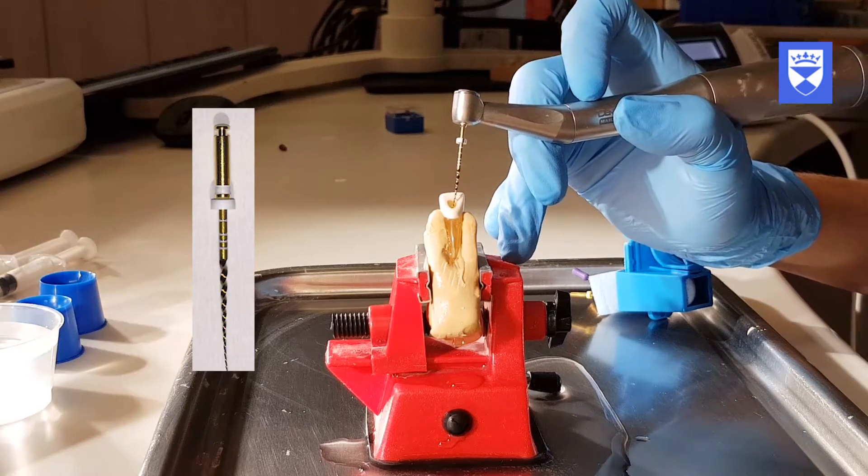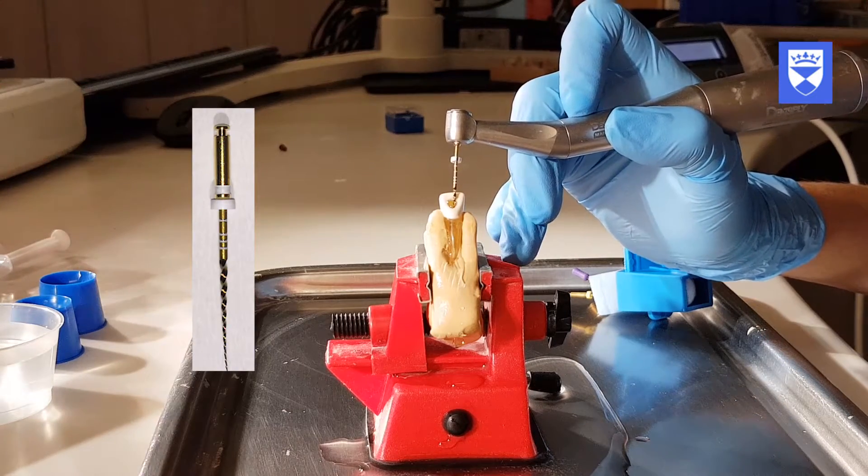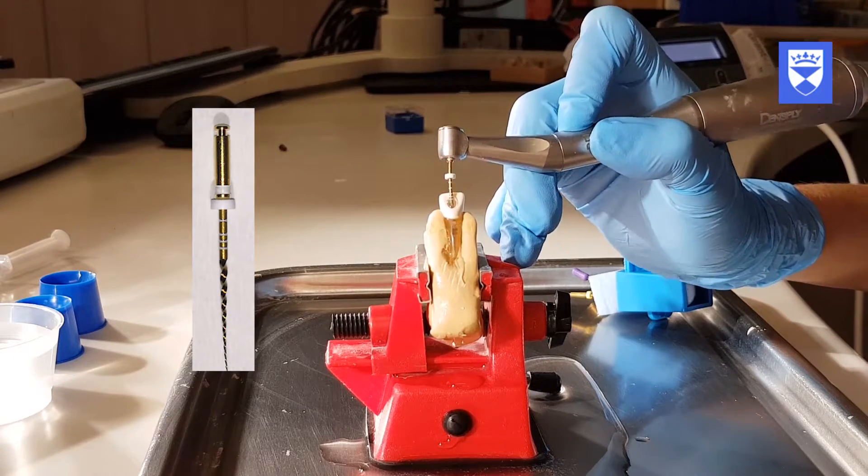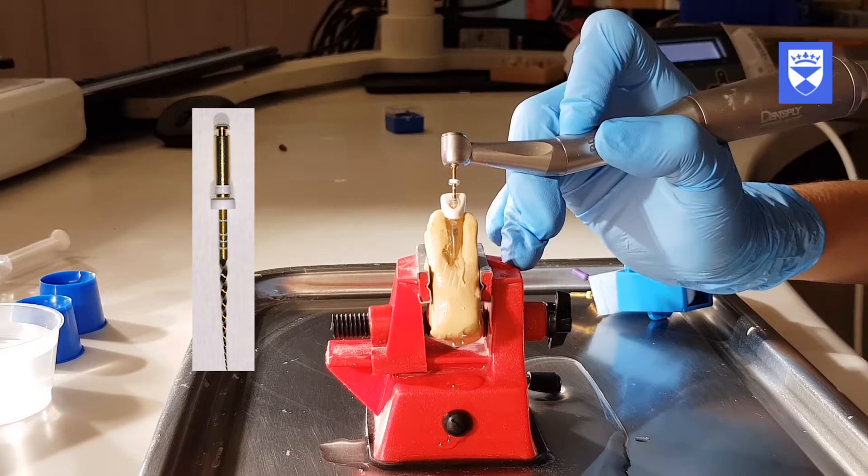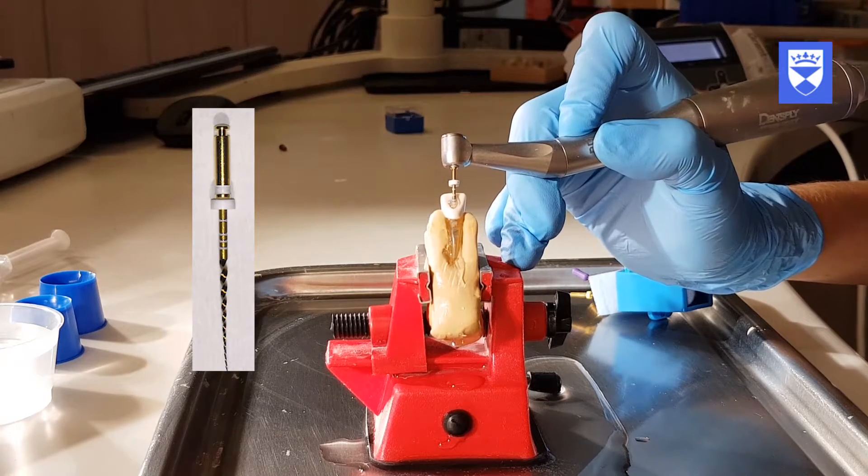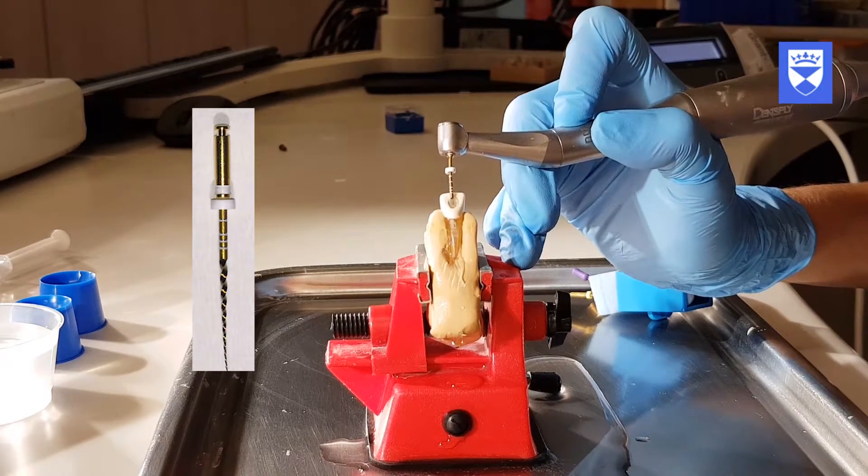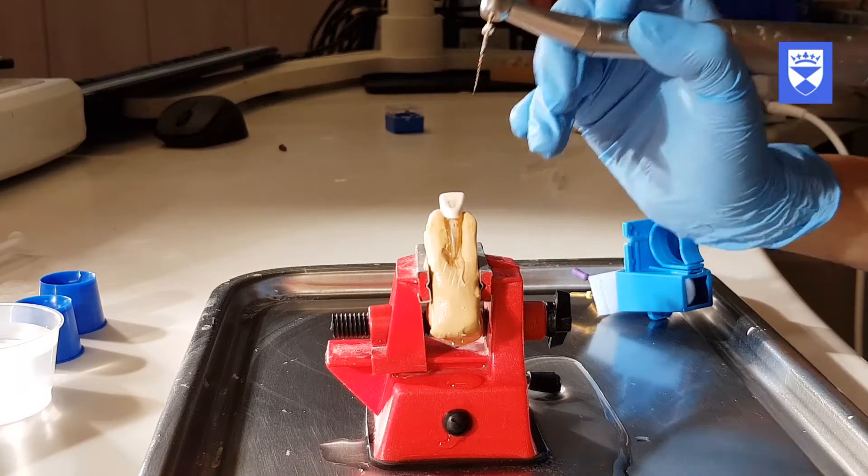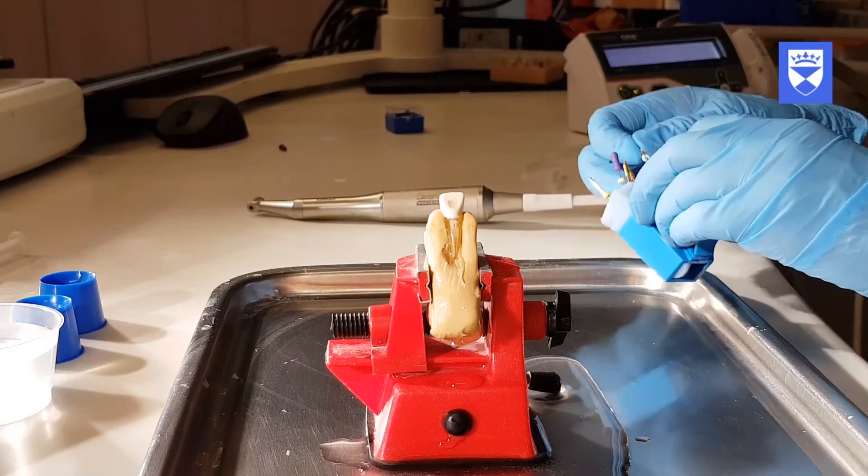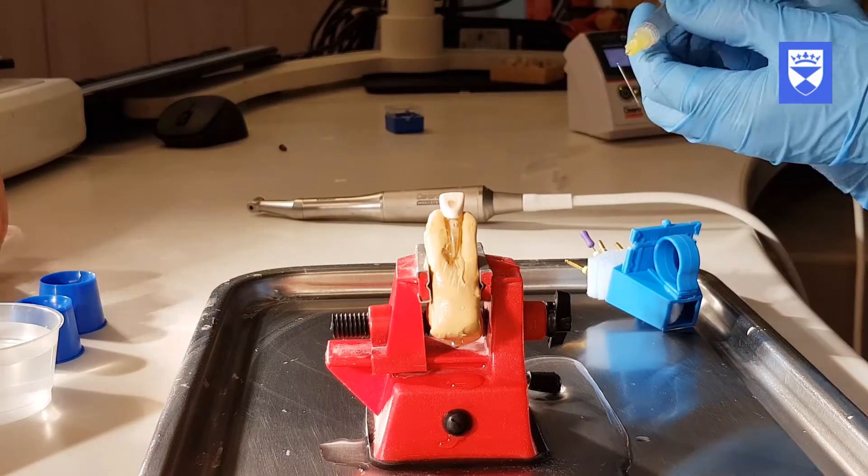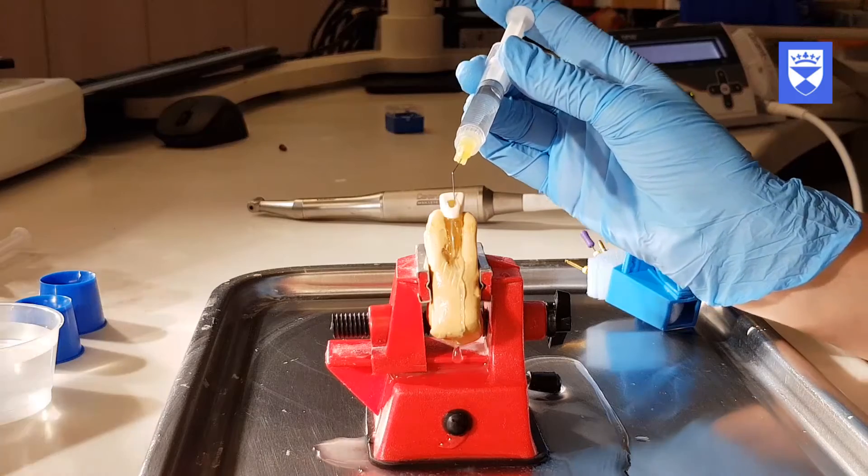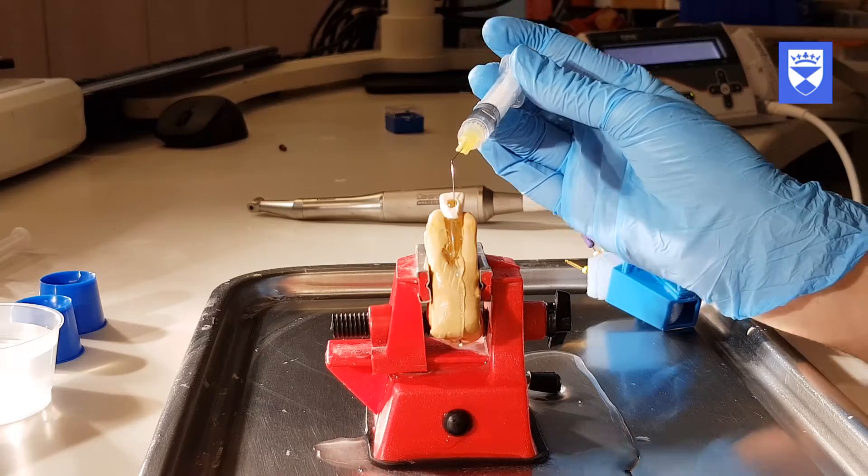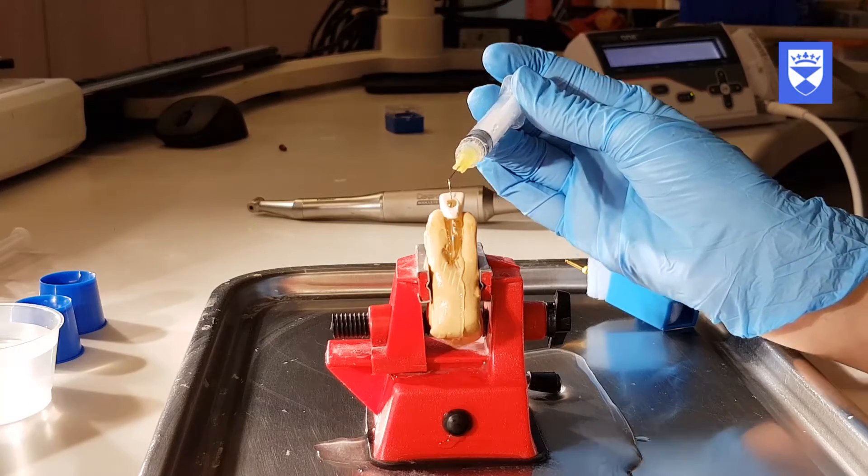The same movement and steps should be completed with the S2 file.